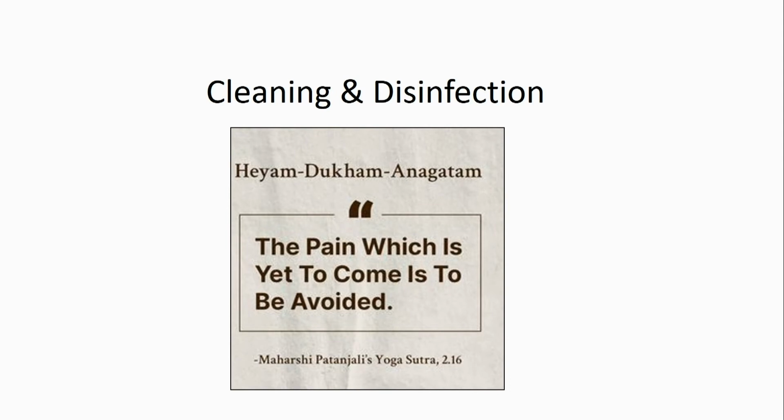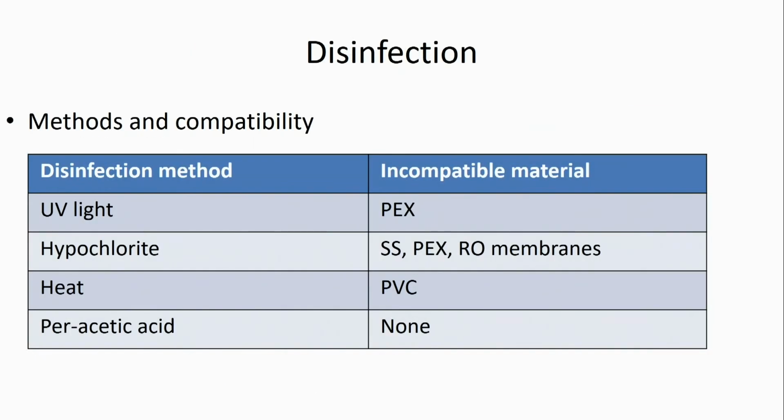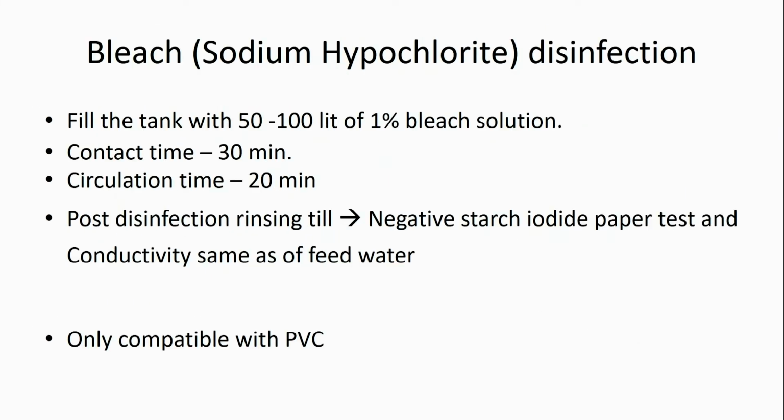There is a Yoga Sutra which says Heyam Dukkham Anagatam, which means the pain which is yet to come is to be avoided. And when you get an infection or biofilm in your water treatment system, then it is a pain. So it can be avoided by regular cleaning and disinfection. But as we are short of time, this cleaning and disinfection part we'll discuss in tomorrow's workshop. Okay, so I will skip to the last slides. These 4-5 slides we'll discuss tomorrow in the workshop.